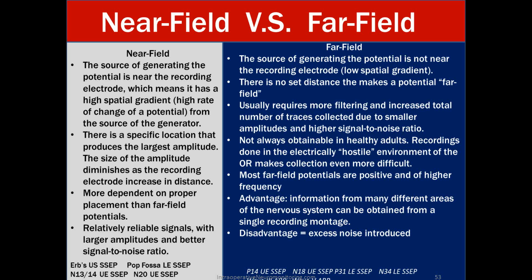So, if you think about it, most people have a subcortical response from the lower extremities, and that is very hit or miss. And then when it does come in, it's usually pretty small in amplitude. Most far field potentials are positive and are higher frequency.